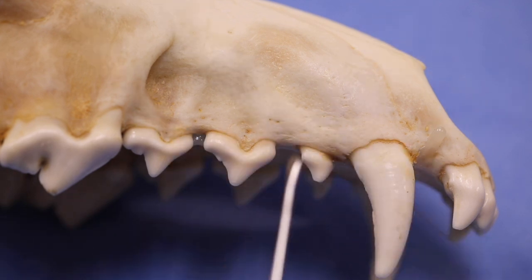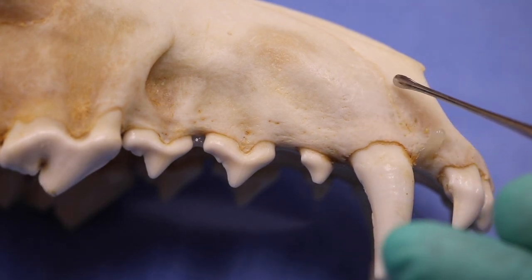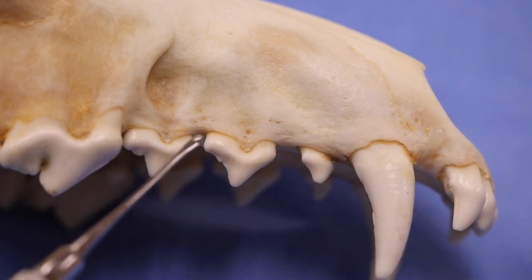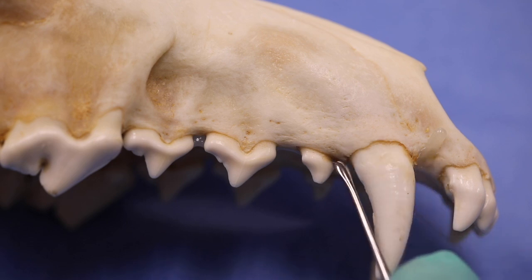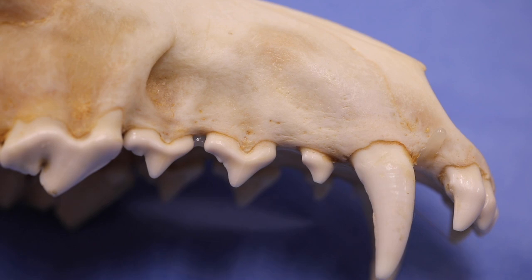When we use this, we want it in this orientation. When we start a flap — say we're doing a flap to expose the canine tooth for extraction — we start with an incision up here in the diastema between the canine and the incisor, which is a vertical releasing incision with a scalpel. We carry it back to the distal aspect of the third premolar, then use the periosteal elevator initially with the small end, especially on the corners and between teeth, to facilitate safe elevation so we can remove bone over the canine tooth and make it an easier extraction by utilizing maximal bone removal.